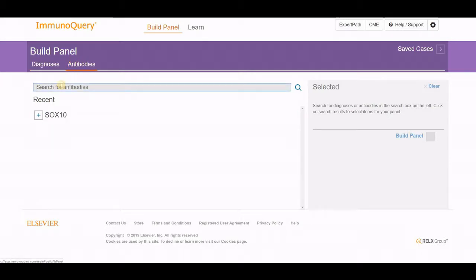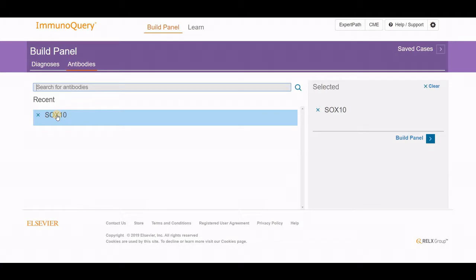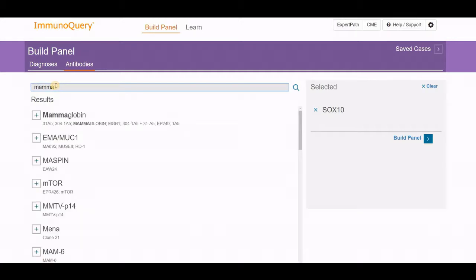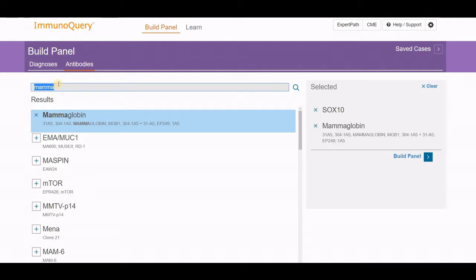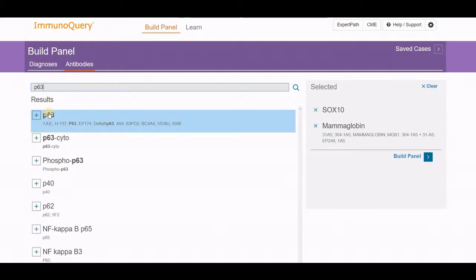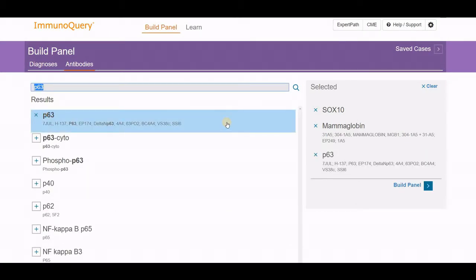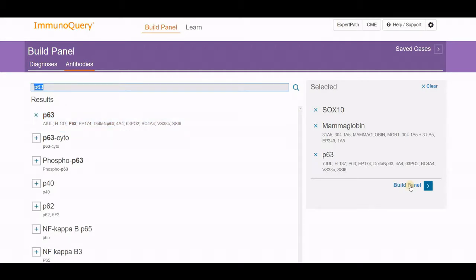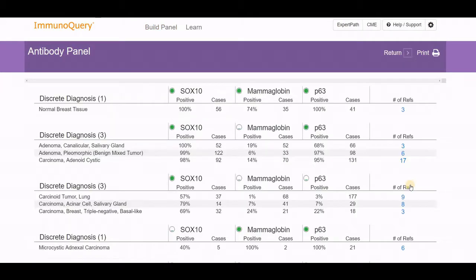Instead of doing a diagnosis panel, why don't we do it based on antibodies? Let's put in SOX10 as one I'd like to include. And let's add mammoglobin. As I'm typing, it progressively fills in so you'll know which is present. And let's put in P63 as well. Here comes the P63 result. This is limited to only three different search criteria. As you can imagine, it becomes exponentially more difficult to separate as you add successive numbers of antibodies. Let's build a panel in this case.